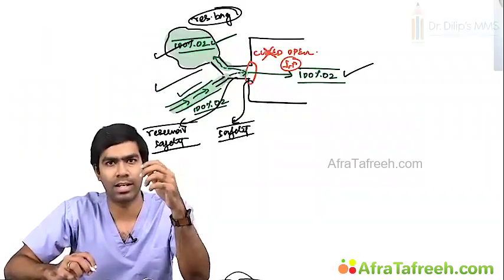So to avoid this, there will be a safety valve which will clearly open in these scenarios. So they will open in case of these extreme negative pressures and they will at least bring in the atmospheric air so that you can start ventilating the patient. Similarly, when you have too much air inside the ambu or the reservoir, another safety valve will be there. Suppose you have a reservoir valve, when the reservoir bag inflates too much because of excessive flow and the patient doesn't need that much, this other safety valve will open and leak some of the pressure and the gas into the atmosphere, so that it will prevent the rupture of the reservoir bag. So these are some of the safety mechanisms that you can have at the inlet area.